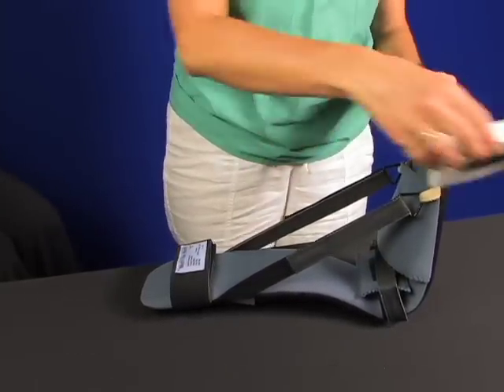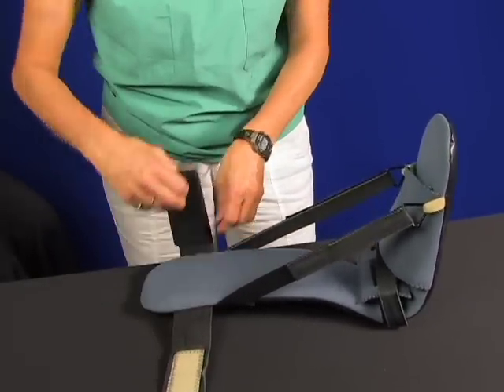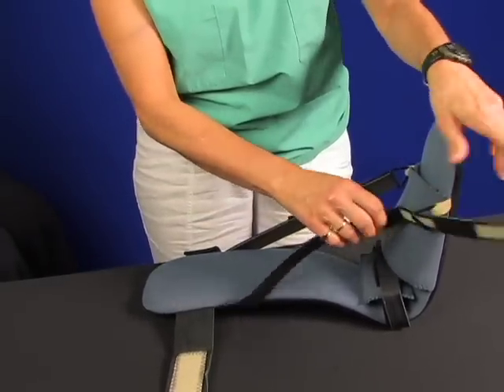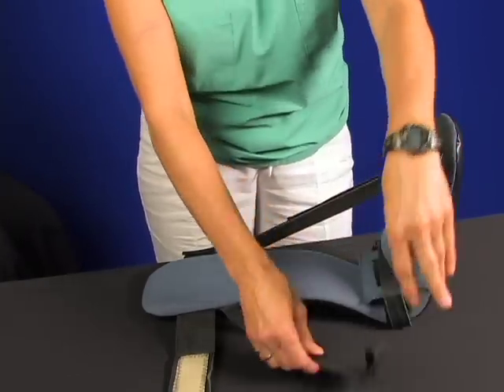To begin the application, remove the foam wedge. Next, you can release the calf strap. Then release one of the side straps. Note the extra Velcro on the strap. This provides a greater range of adjustment.